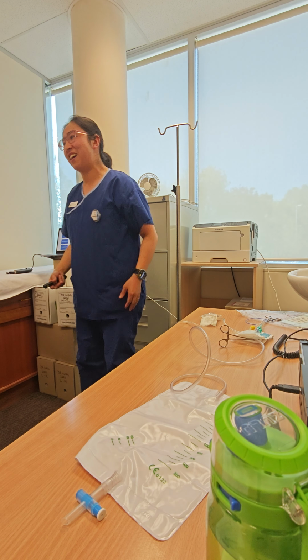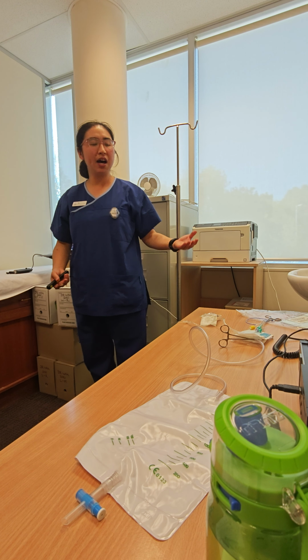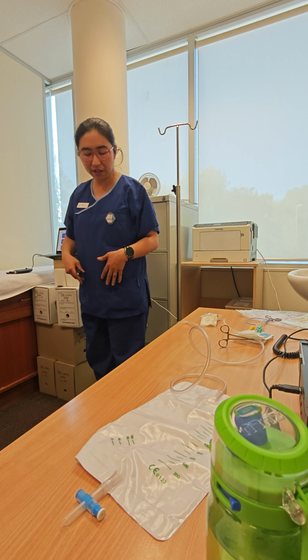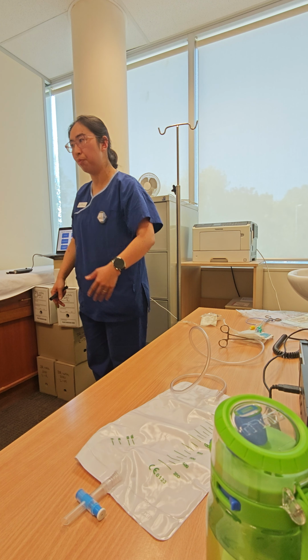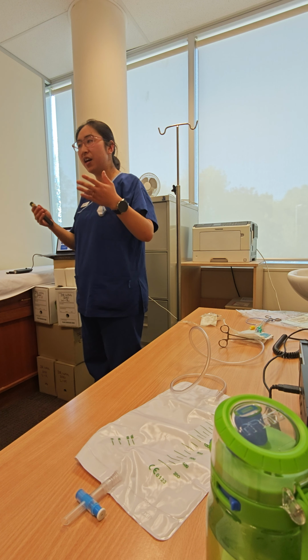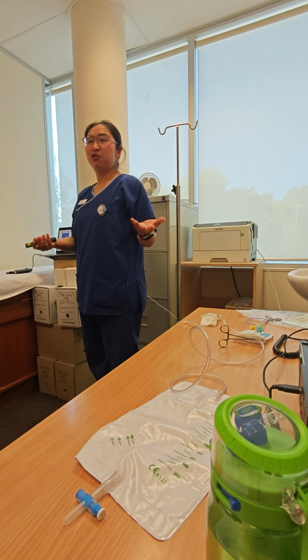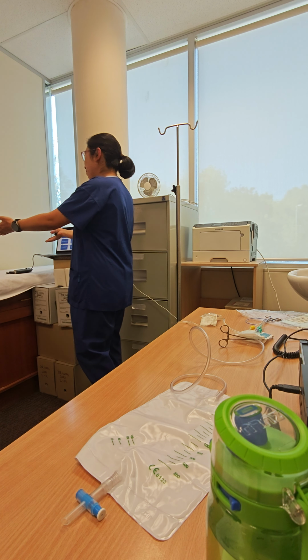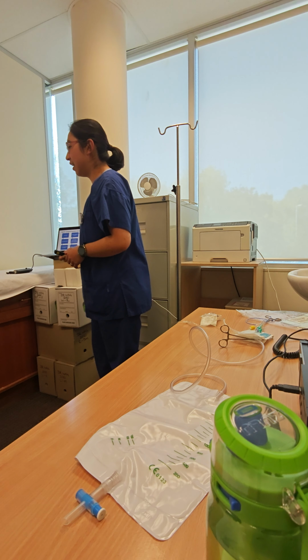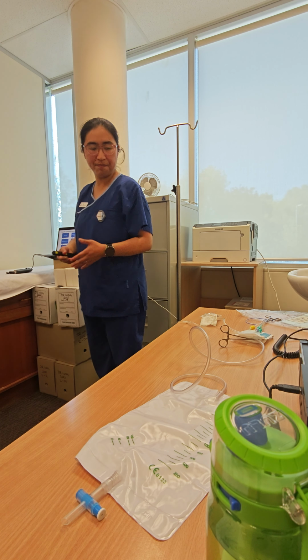And we might ask our patient to stand up for 5 or 10 minutes. We're gonna ask the bladder to drain all the contrast back to the original bottle. It might happen, might not happen, but we're gonna have another X-ray, we call it the post X-ray. After 5 or 10 minutes, ask him to go back and lie down on the bed again, just to have a picture to see if the bladder is clear, no contrast.